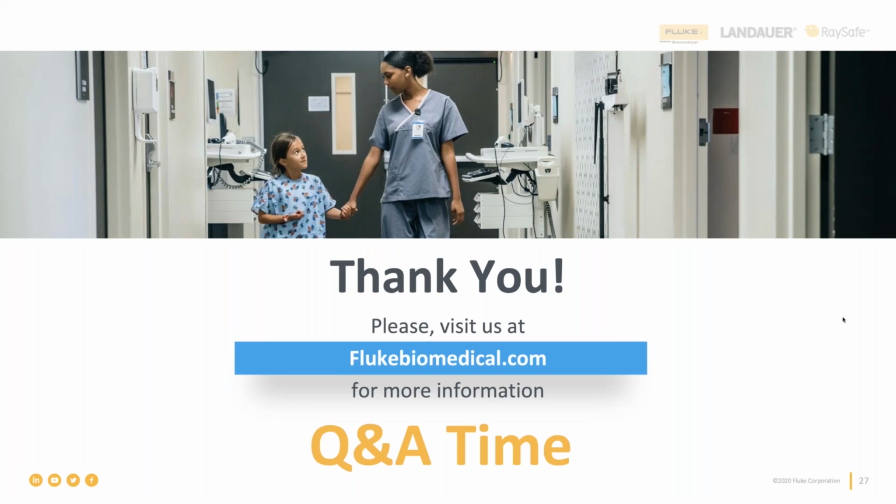Okay, so the first question is, how do you calibrate your SpO2 simulator? Okay, I'll take this one. In terms of calibrating your SpO2 simulator, I just want to correct the terminology. It's not a simulator, it's a functional tester. And in terms of calibration, it's not actually calibrated. It is verified.